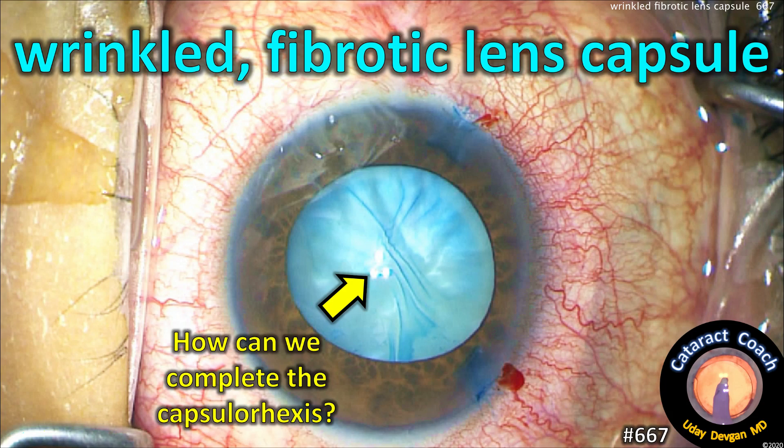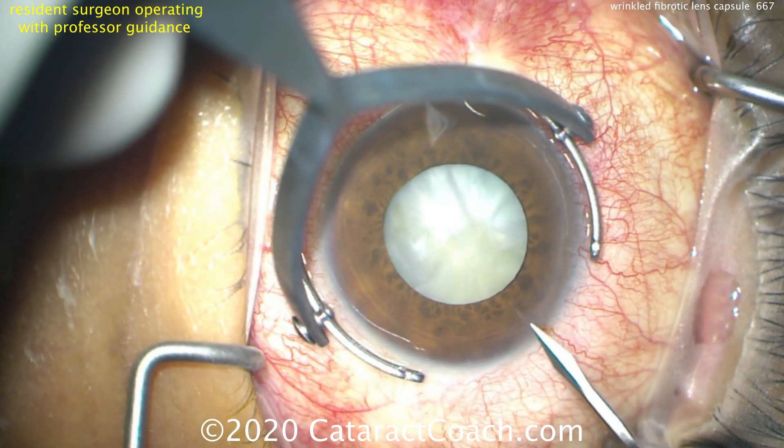CataractCoach.com. A wrinkled fibrotic lens capsule — so how can we complete the capsulorhexis for this intumescent white cataract?